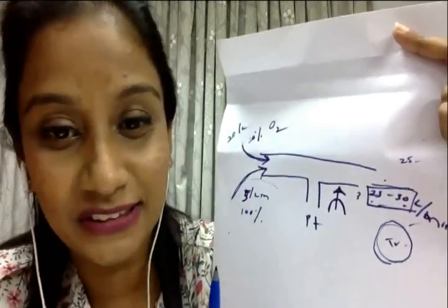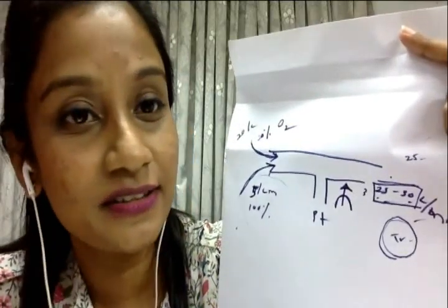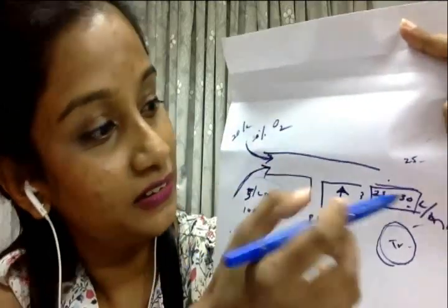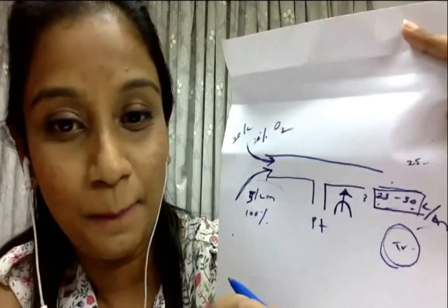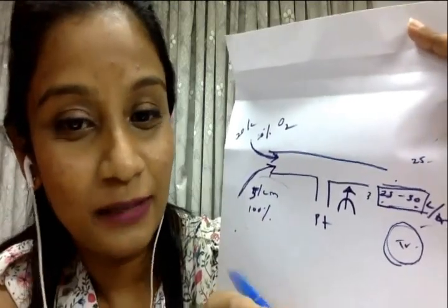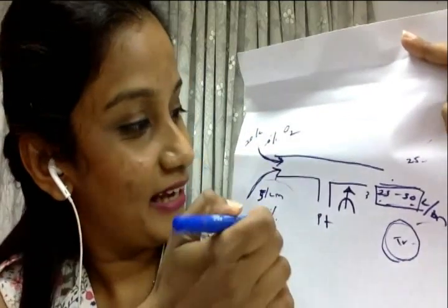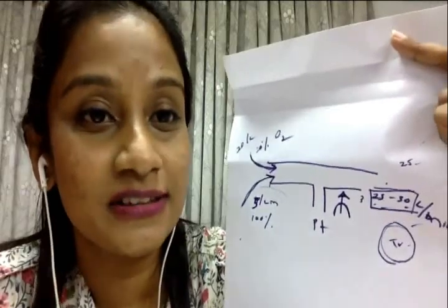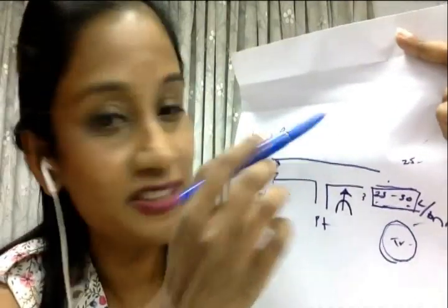That is how it happens, right? If you calculate it, you can actually calculate the fraction of oxygen that goes to the patient. If the patient is not on any oxygen, the whole 25 to 30 liters would be taken from the air, right? But if you have another device where it delivers 10 liters, the dilution is going to be different. That is how the fraction of oxygen delivered to the patient differs depending on the device factors.